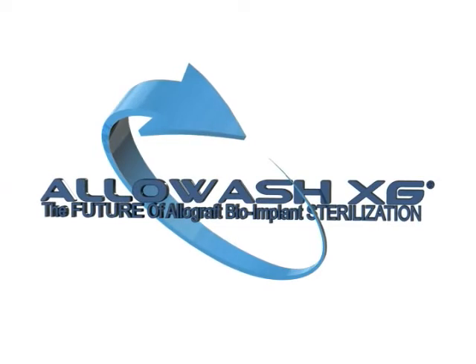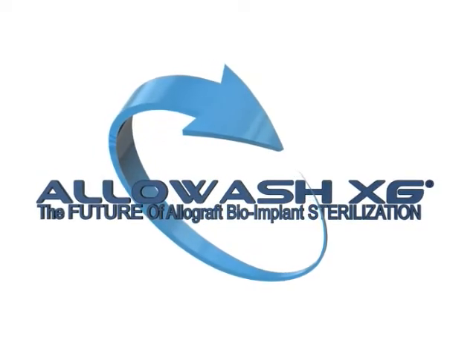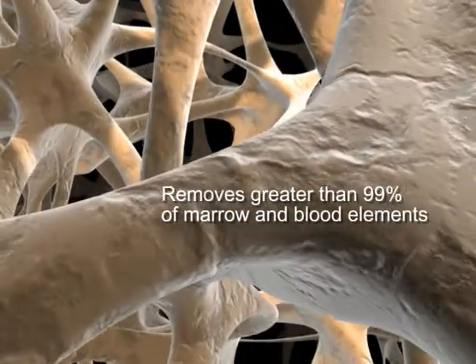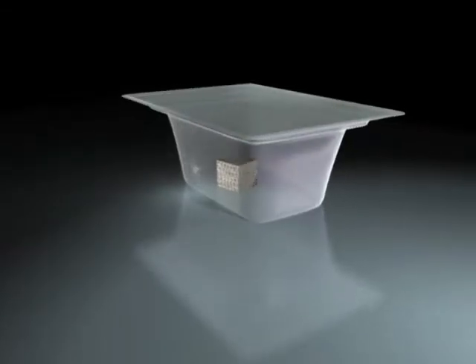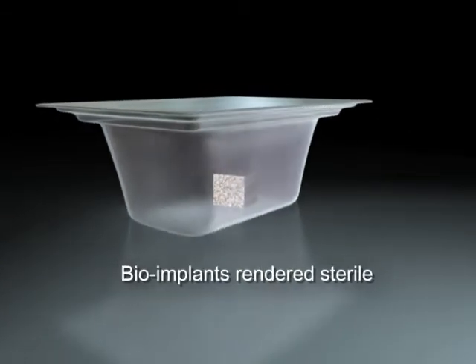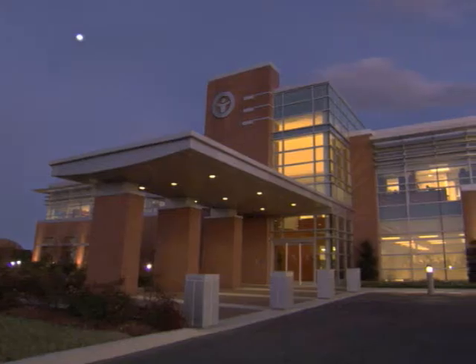LifeNet Health's Allowash XG is a patented, proprietary cleaning and sterilization process that removes greater than 99% of marrow and blood elements from the internal bone matrix. It renders allograft bioimplants sterile without compromising the biomechanical or biochemical properties needed for their intended applications.